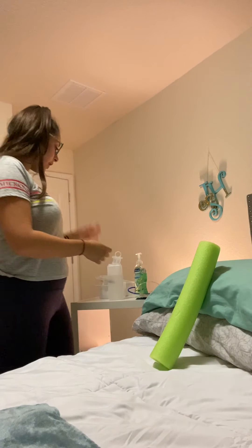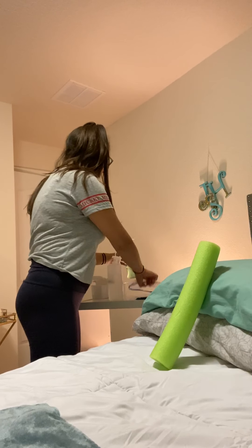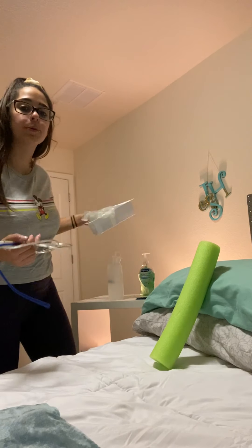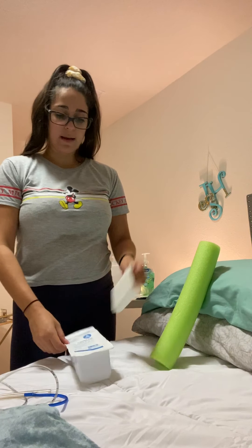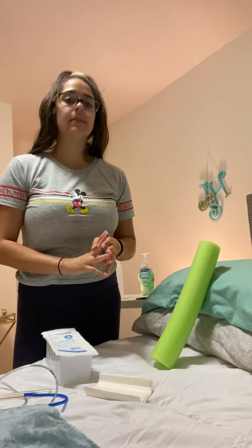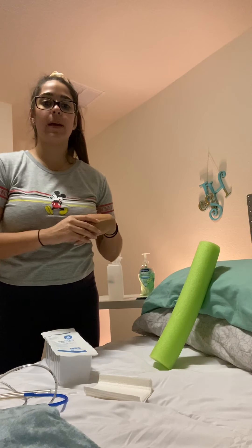Next I'm going to perform hand hygiene and wash my hands. I'm going to gather all my supplies that I'm going to be needing. Then I'm going to head into my patient's room, introduce myself, and ensure patient privacy. I'll identify them with two patient identifiers: their name and date of birth.